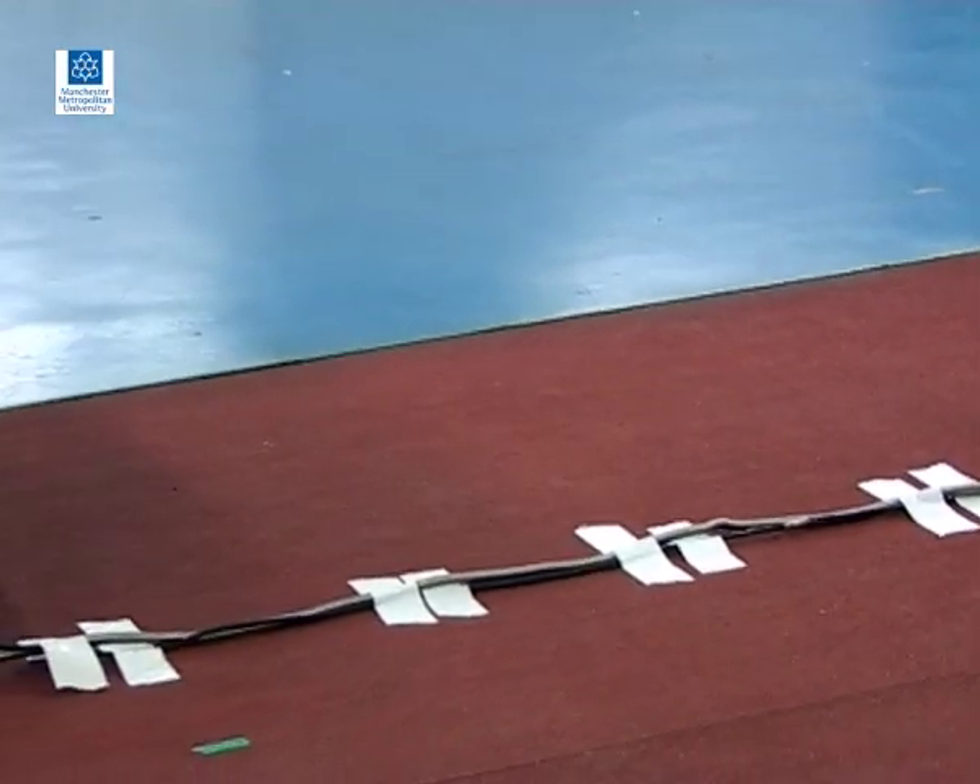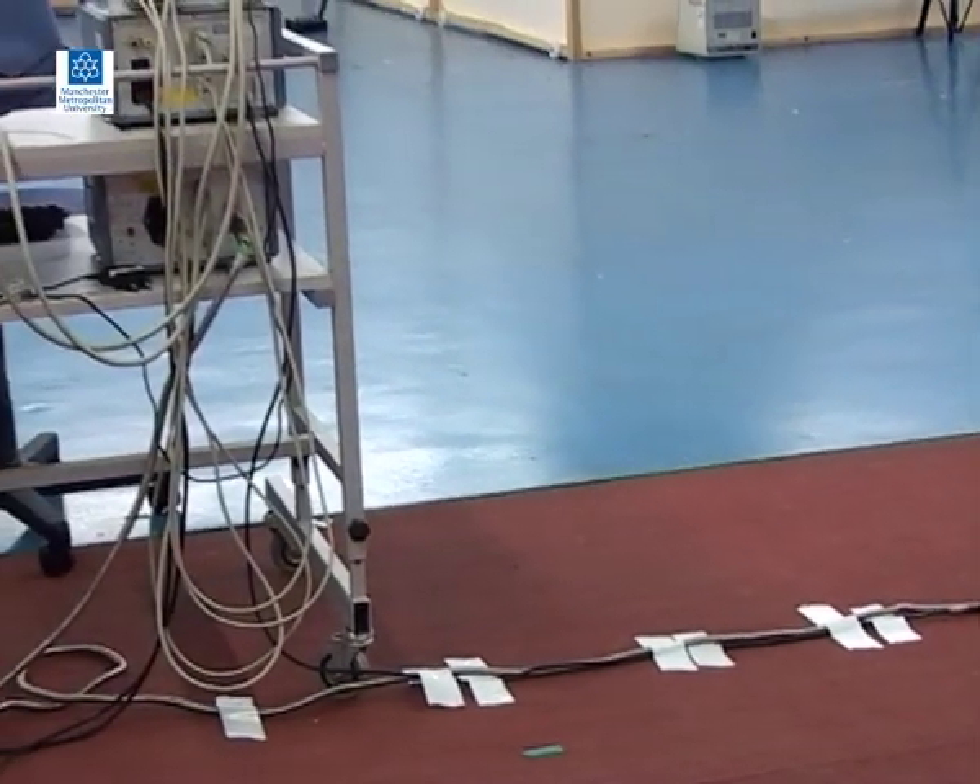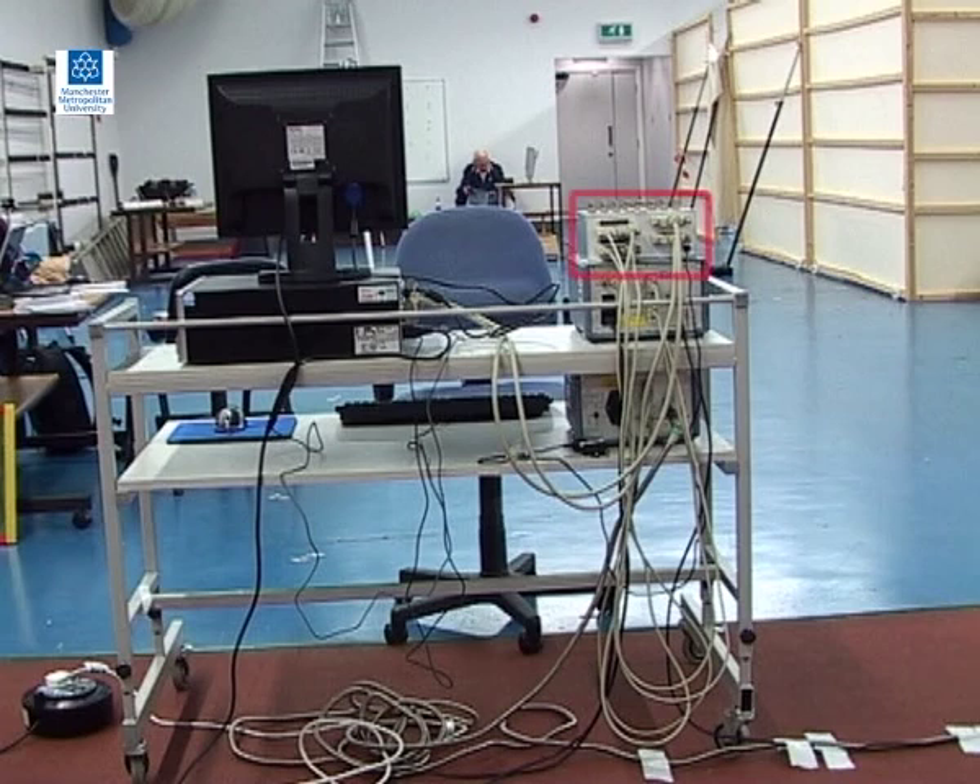A cable connects the force platform to an amplifier. On top of the amplifier you can see a connection box that is used to synchronise the force platform with other measurement devices. For example, an LED in the field of view of a camera would enable video to be synchronised with force data.